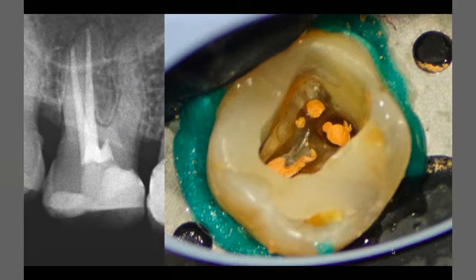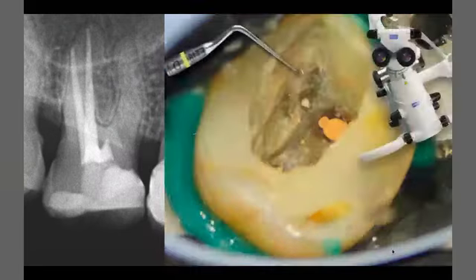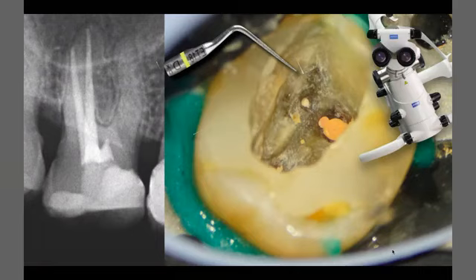After 3 months, the patient started to have pain on biting, and the tooth was sensitive to percussion. So he referred the case to me, and according to the X-ray, I have to open the root canal because I have symptoms now. With more magnification, and when you dry the pulp chamber after the ultrasonic tips dropping on the mesial side, dry as much as you can, and you will see the root canal orifices clearly.